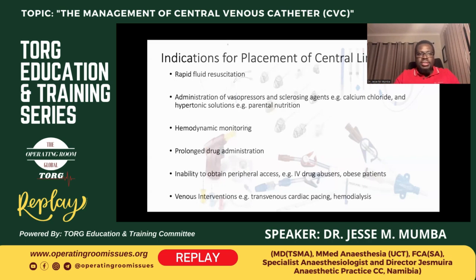Also, when it's not possible to obtain peripheral access, either because this is a baby that is severely dehydrated, or a patient who's severely septic and has gone into peripheral shutdown, central lines are usually the way to go. The other indication would be in very obese patients where you can't obtain a peripheral line.